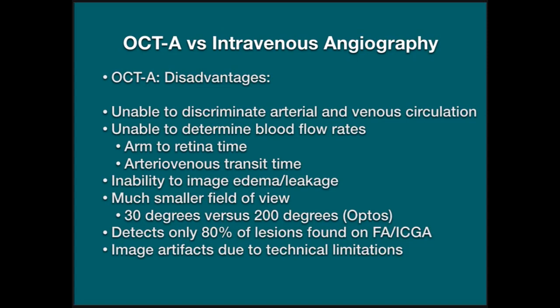In one of the studies recently done, they looked at how OCT angiography compared with dye-based angiography, and the OCT technology was only able to detect 80% of the lesions that were found by fluorescein angiography. So it's not yet able to detect everything that dye-based angiography can detect.